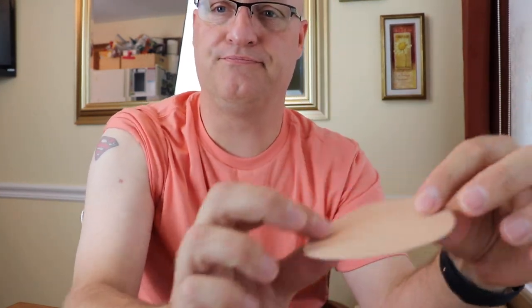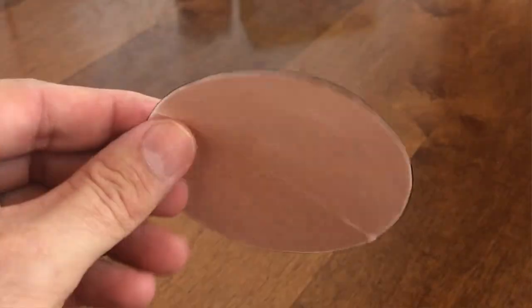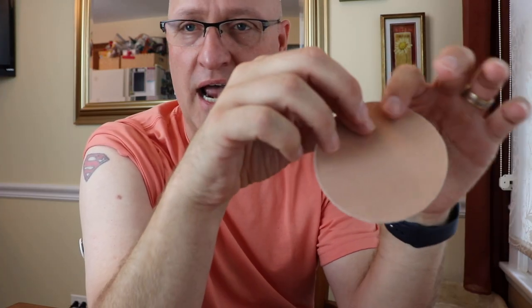I'm going to talk about two different patch options. I have started using one of two different patches. This first one is a flexible material patch. What will typically happen is right around the 10th or 11th day, the sensor will start to peel away. I don't use this one very often anymore because after about the sixth day it starts to fray along the edges because of the material. You can buy these on Amazon — they're about $16 for 25. They're called the Flexic Freestyle Adhesive, recommended with sensors like this, but I don't particularly like them because they get threadbare.